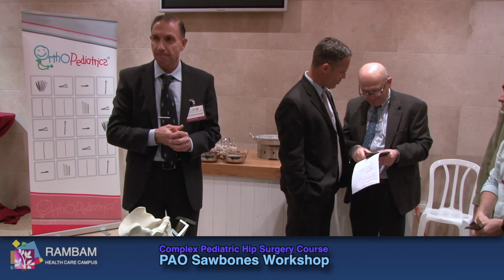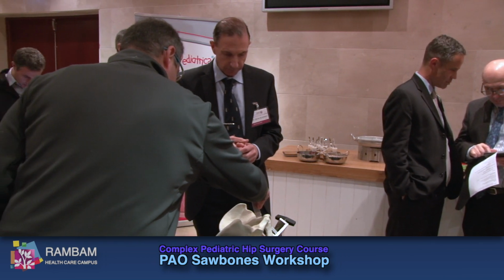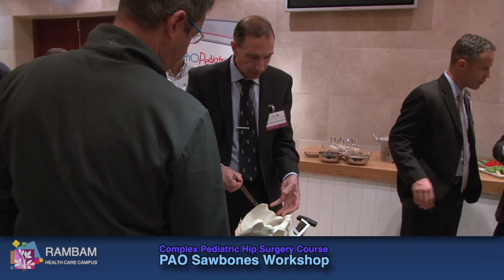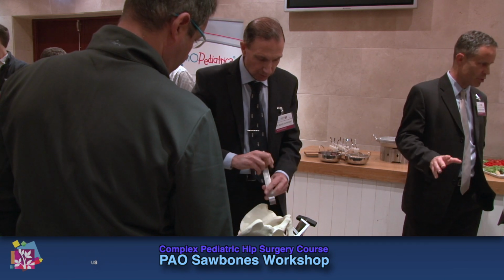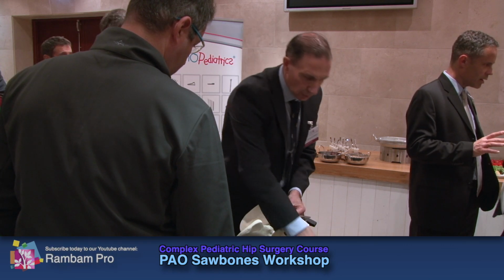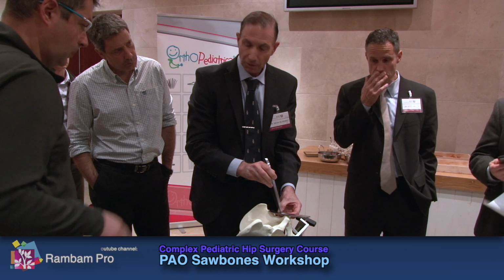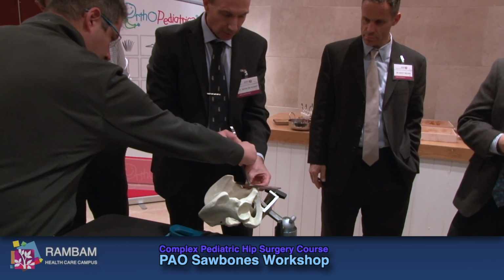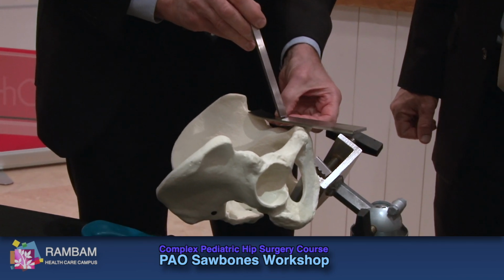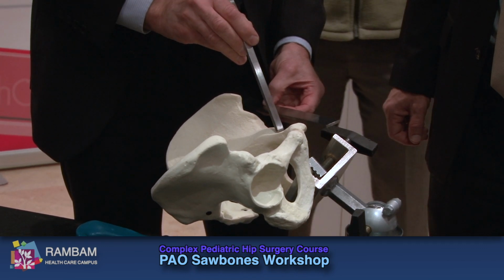With the pubic cut, how do you position that direction? So the cup you want to change like that and like that. So you want to go in this direction, so that the pubic ramus is in that direction. You want to be perpendicular to that. Not so much, because the pubic ramus is already at that angle, you're going almost perpendicular to that, you can just incline it this way. If anything, do that. What you don't want to do is that. If anything, that way, but certainly this way.